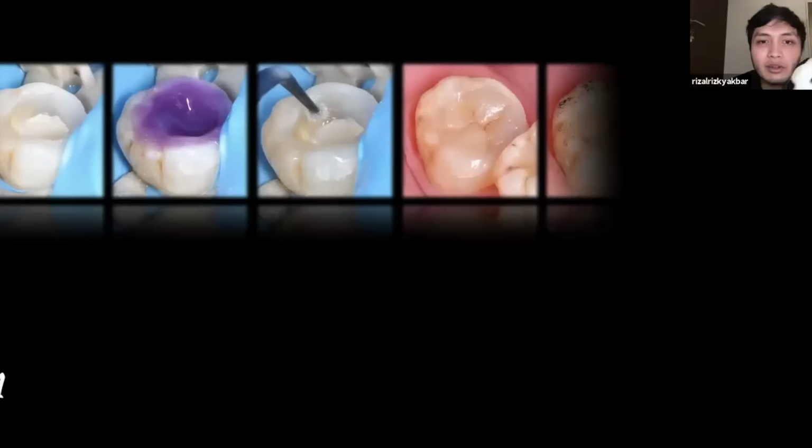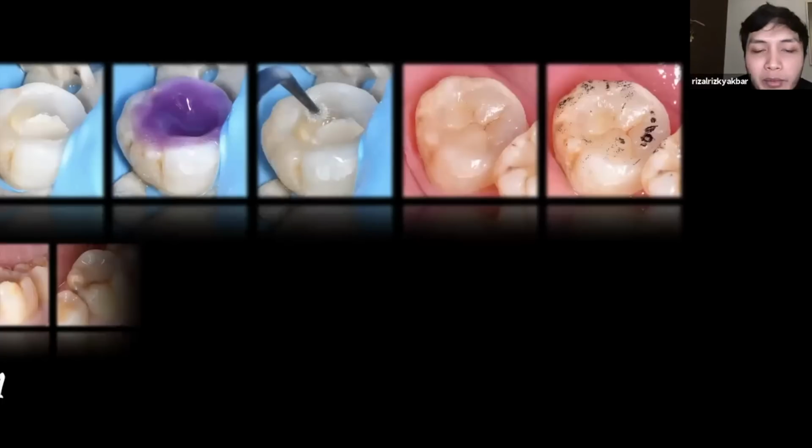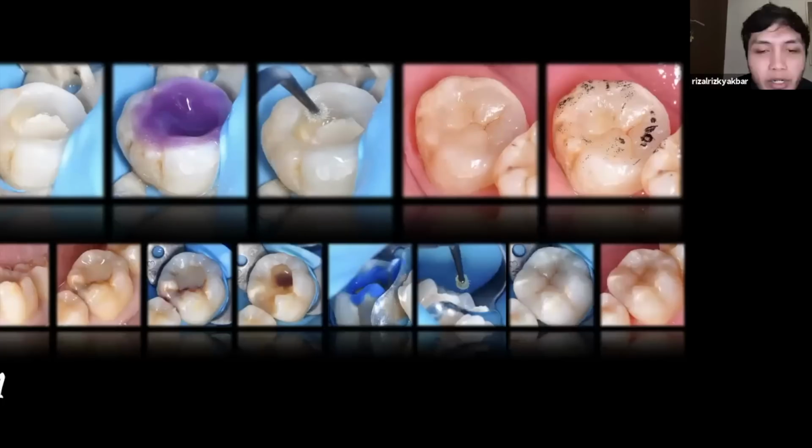Yeah, I have a patient who has really limited mouth opening. And it was really hard to see the tooth to restore it. So I managed to place rubber dam first, and then boom, I can do the filling in 1 hour, even though the patient has a limited mouth opening. Because the patient is not realizing that he opened the mouth, because there's a rubber dam retraction. So rubber dam will provide you with very good retraction and then visibility and access.